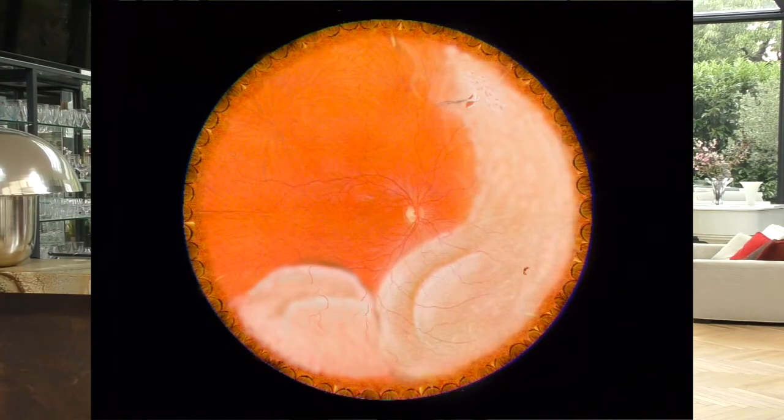You can therefore tell the story of this detachment. It is a detachment of the phakic, stage A. I saw 2 small tears, and I'm sure that there are no others. The first, on the posterior edge of this lattice at 1 o'clock, is at the origin of the detachment.